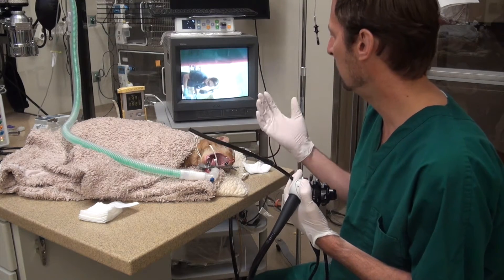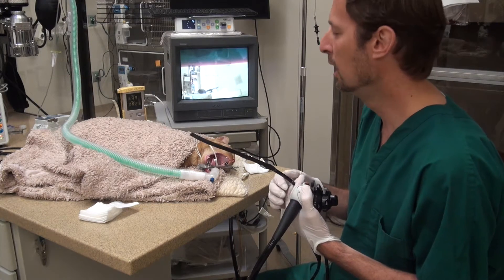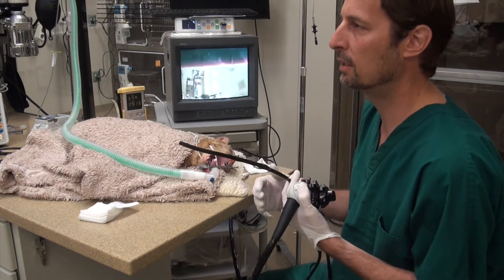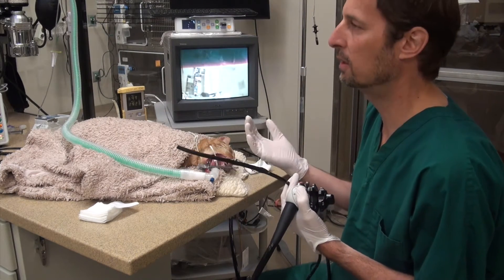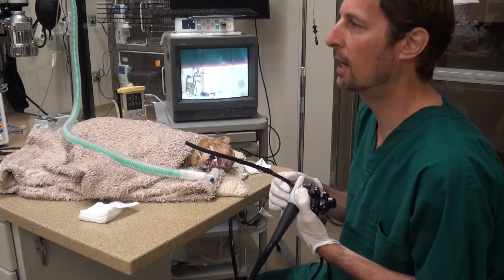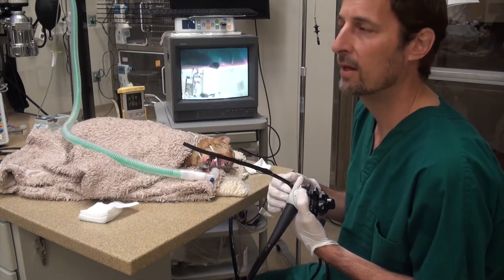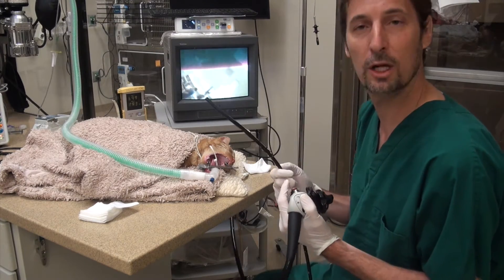So anyway, we're going to do an endoscopy. This is one of the services we offer at Conejo Valley Veterinary Hospital. It's great because if we can get this foreign body out with an endoscope, this little kitty can go home tonight and doesn't have to spend the night. I don't have to do any invasive surgery where I open up the abdomen and actually go into the stomach to remove the foreign body that way — that would be a two-week recovery. So hopefully we'll get lucky. Here we go.